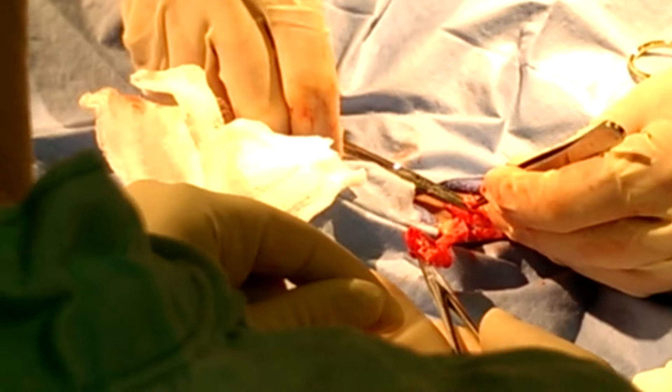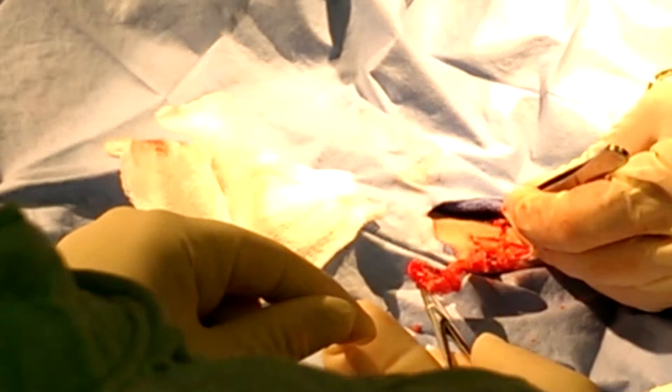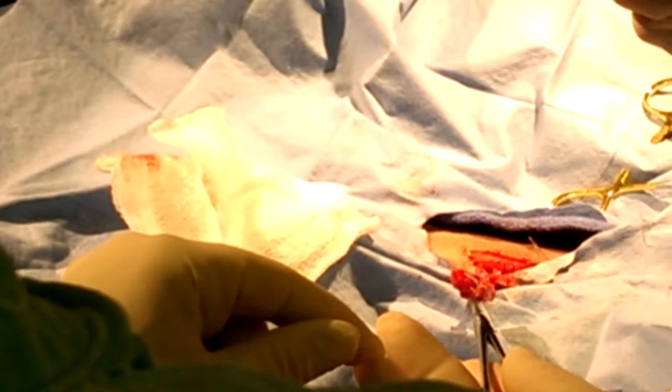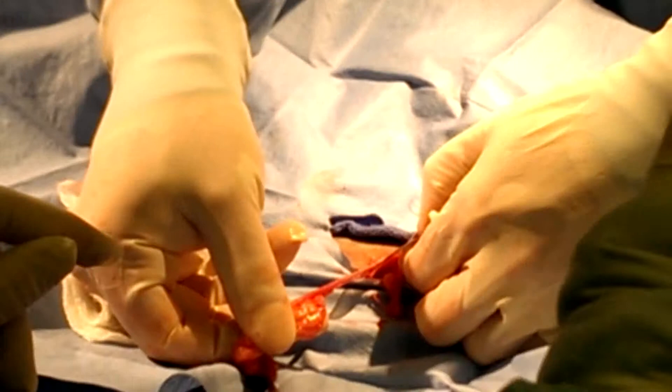Always hold on to the tip as you release — see if anything is starting to bleed. Even just having tension on it can keep a small blood vessel from bleeding. So gently release — everyone looks happy. This is still more of that broad ligament; we just tear this until we get to the bifurcation. Now we're going to do the exact same thing to the other side.